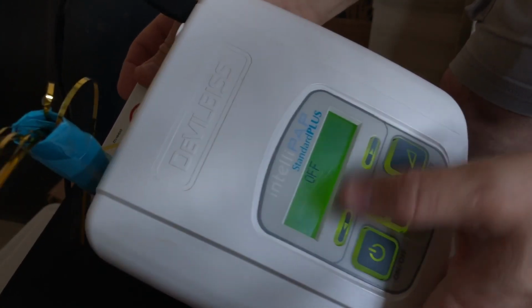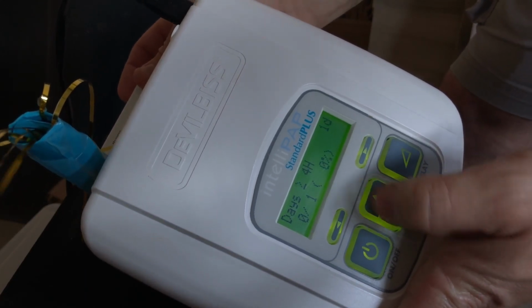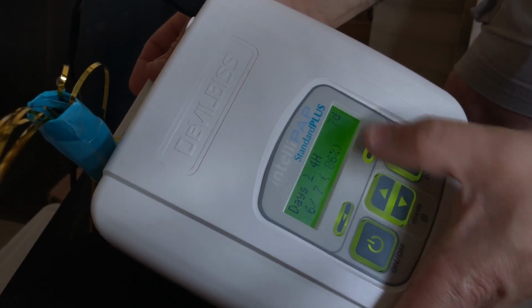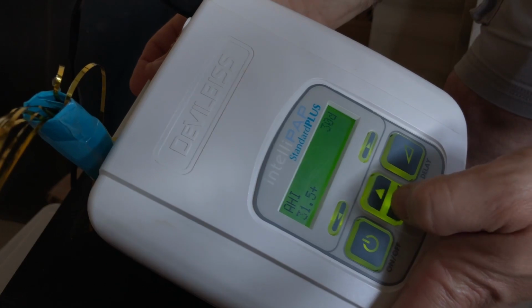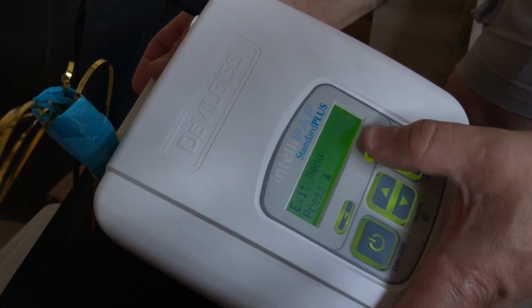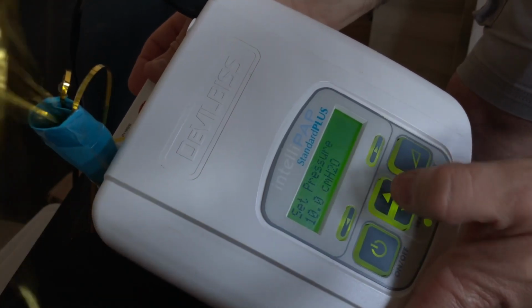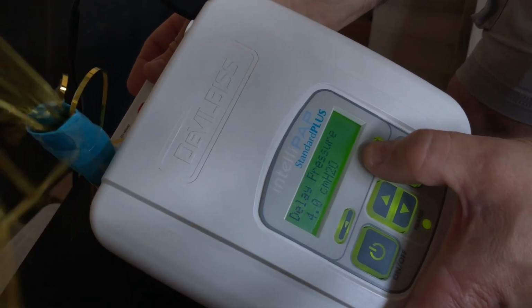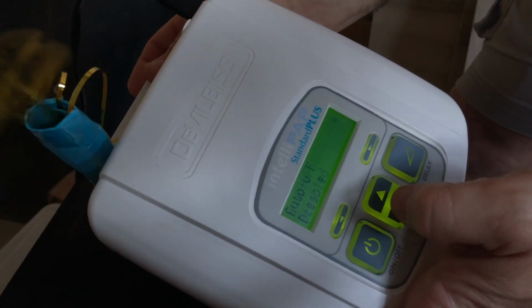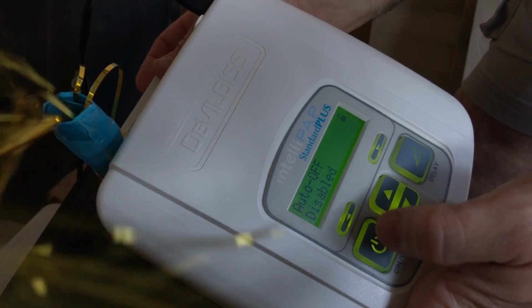Are there any settings here? Yeah, you can do a few settings quick. View menu, days. I'm not sure what exactly that is. AHI, high leak, daily usage hours, exit menu. There's a few other things in here. You can check the ramp time, pressure, tubing length, and what else is there? Mask fit, please check mask fit. Okay, we know that. Off.